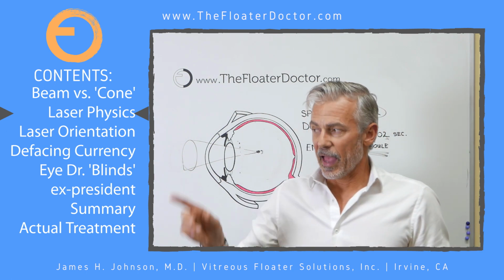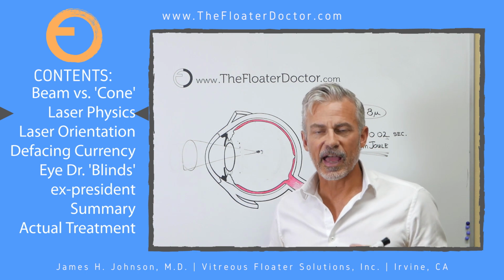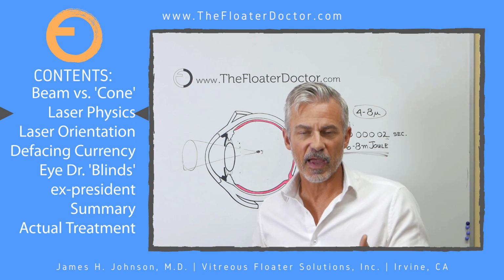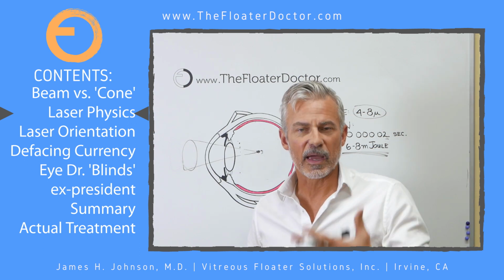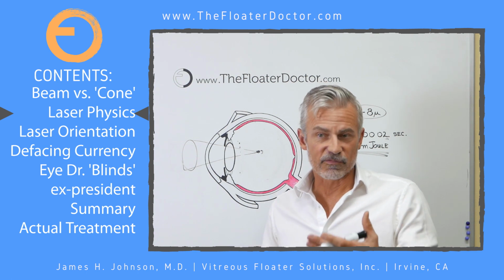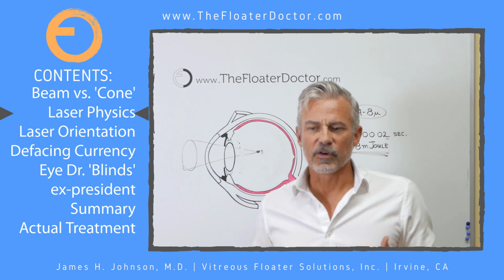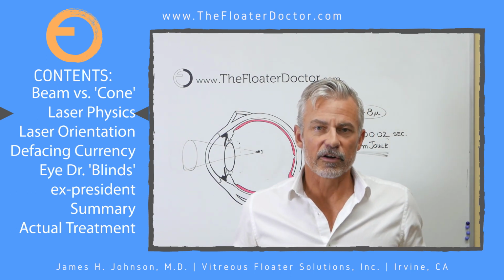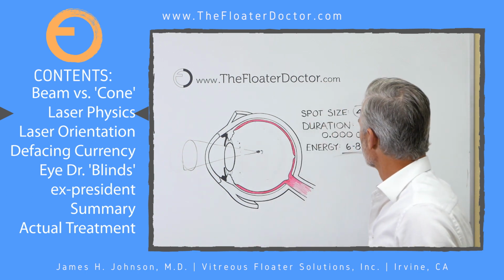It's very, very low. And when we go back over here to the laser, I'm going to show you how I can actually focus on the ink printed on top of paper and selectively remove the ink and leave the paper alone. And it's very precisely focused, with a very narrow depth of field that's in focus. So it's a neat little demonstration of how low energy it is, but also how accurate that is. I think that covers what I want to cover here.